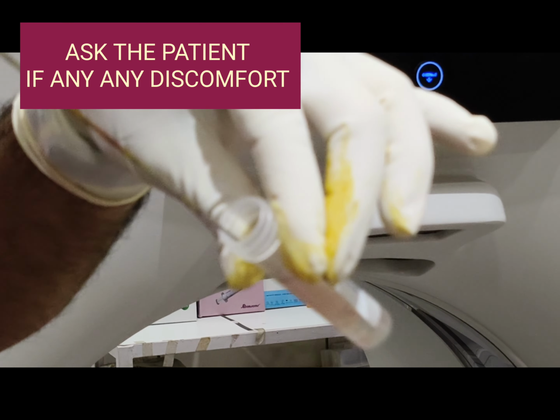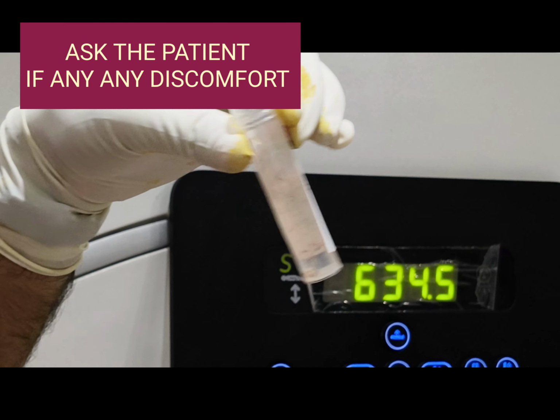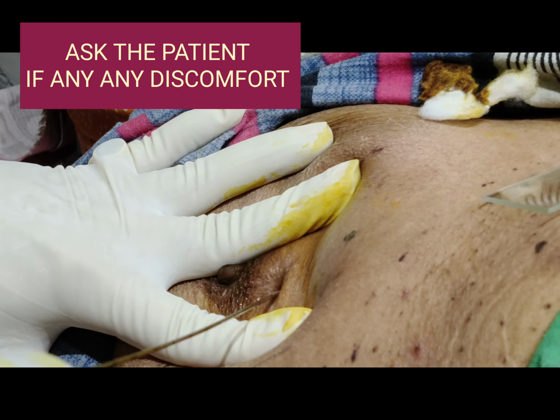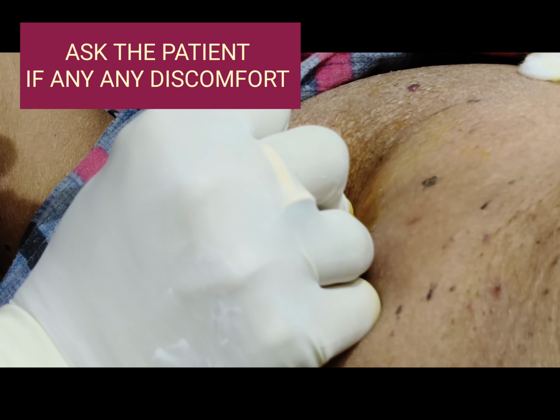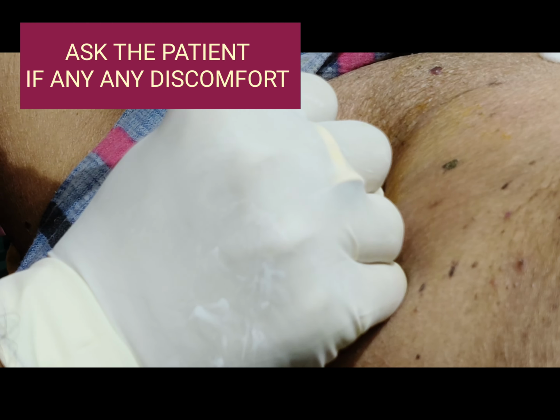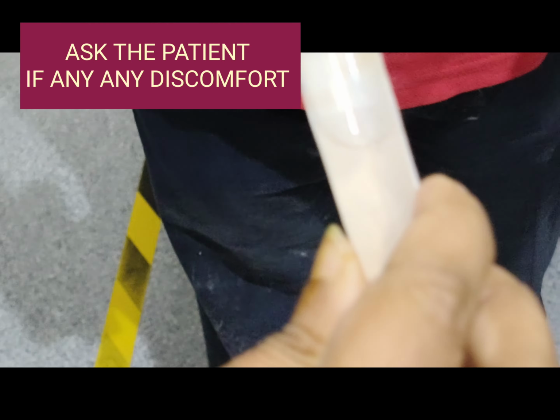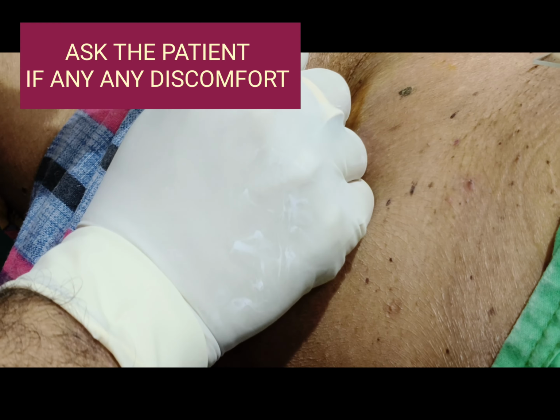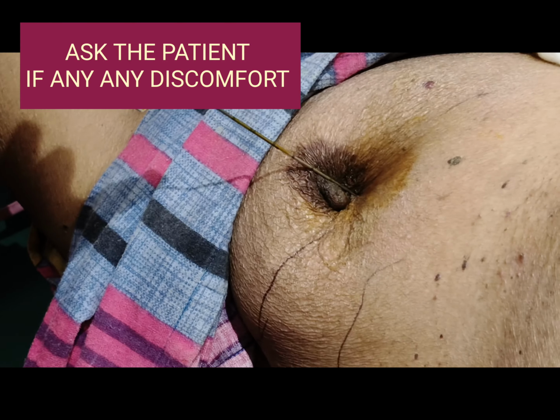In the meantime, we talk to the patient if she or he is feeling any discomfort. In this case, she is saying no, nothing is happening, no problem. So we can take more passes, more tissues. We are collecting about 10 tissue cores for various studies. There are many tests like immunohistochemistry, EGFR test, ROS, etc., molecular tests.